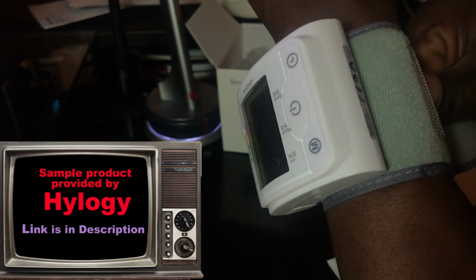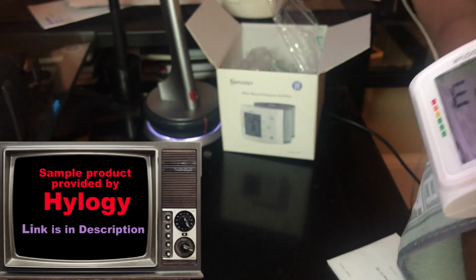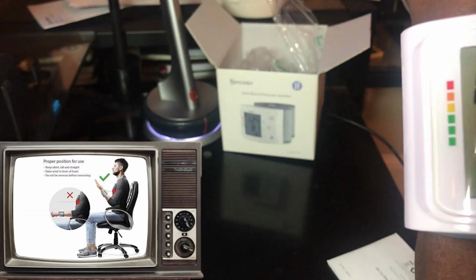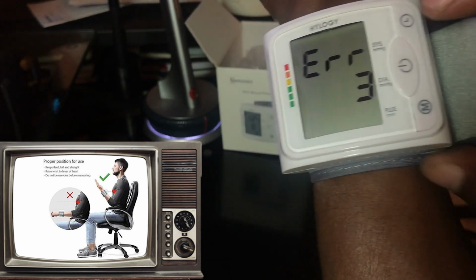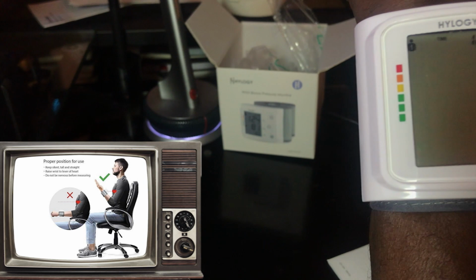It takes a little getting used to. So I'm gonna pull that right over. I'm not sure how tight I'm supposed to make it. So now I've got it on my wrist and we're gonna give it another try. So power it on.